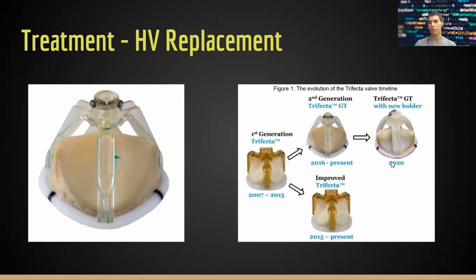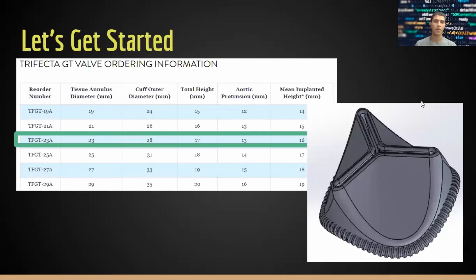Today we'll be modeling something close to the 2020 design. It does not include the new holder for the heart valve — the holder allows it to retain its shape since the valve is composed of different tissues sewn together. This information is available online with the different specs, and this will be the model I'll be designing. From here, let's jump over to SolidWorks.